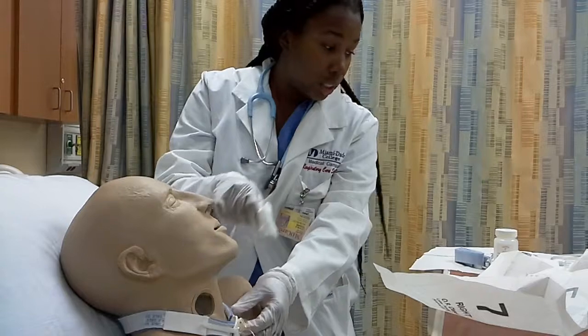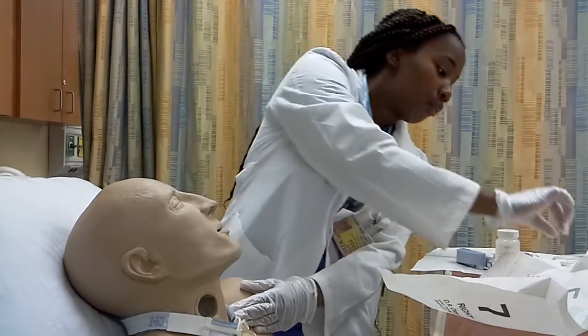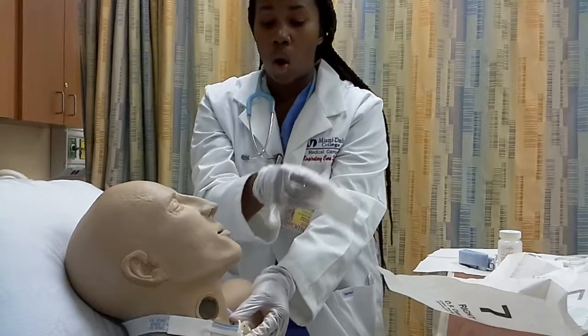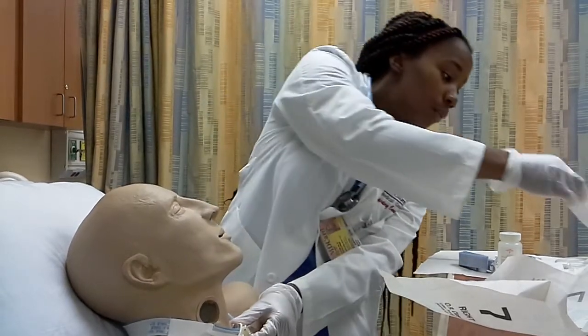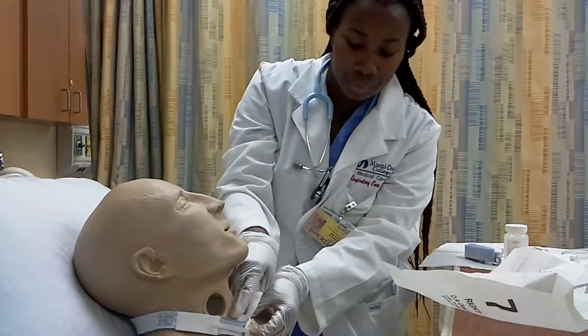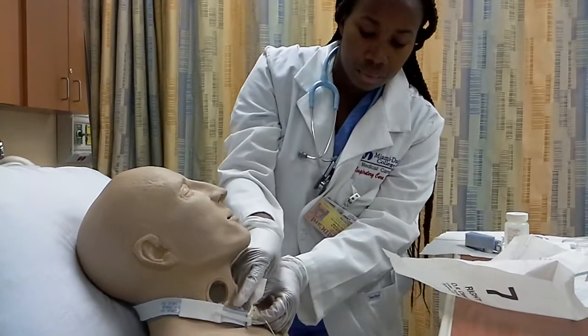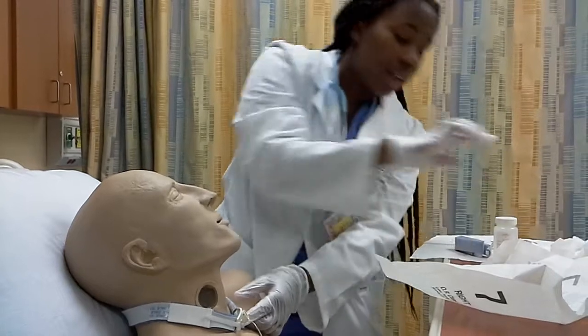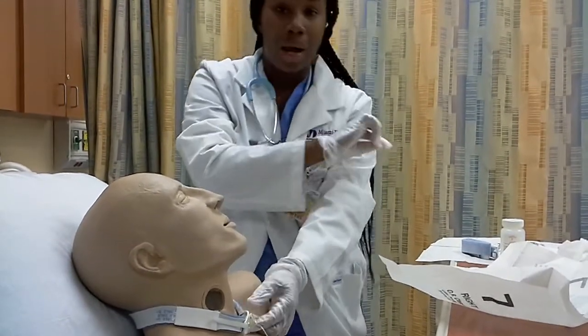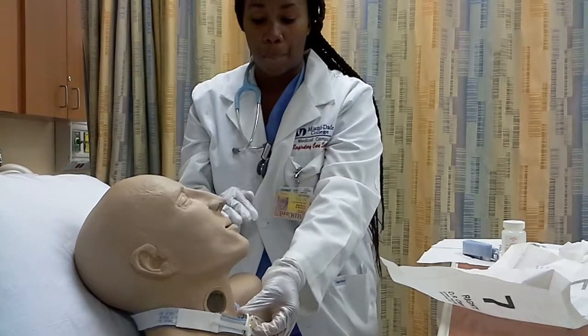So after I have cleaned his area, I'm going to go ahead and get another pre-cut gauze, and I'm going to dip it in the sterile water, still maintaining hold of my trach tube. Dip it in the sterile water, and I'm going to go ahead and rinse the area. Now, if there are some areas that I couldn't get into with the gauze, I will go ahead and use my cotton applicators. That's what those are for.